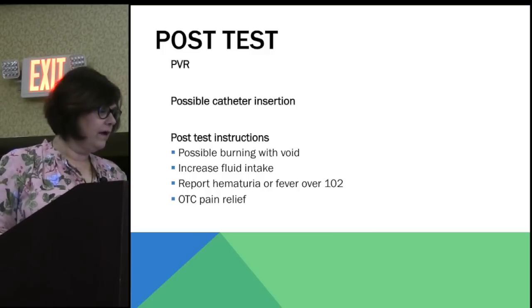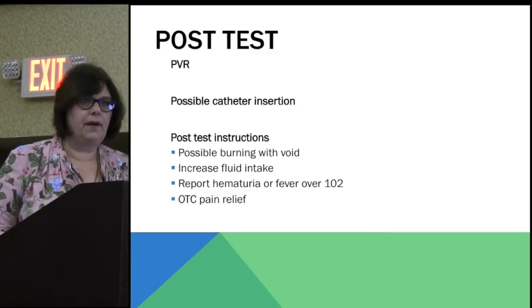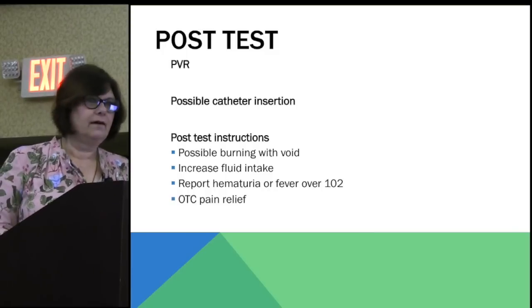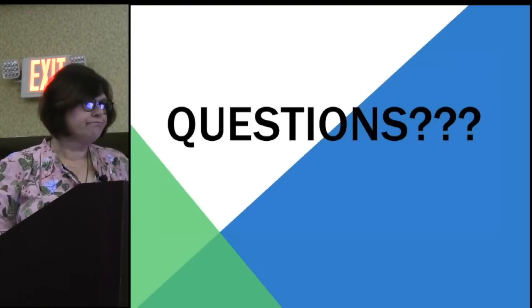They need to report that to you so we can test for or treat for a UTI. And then over-the-counter pain relief. Again, I tell everybody to take something after the test just to get them through, and usually that takes care of their complaints. I rarely, if ever, have anyone come back and complain that they've had issues.